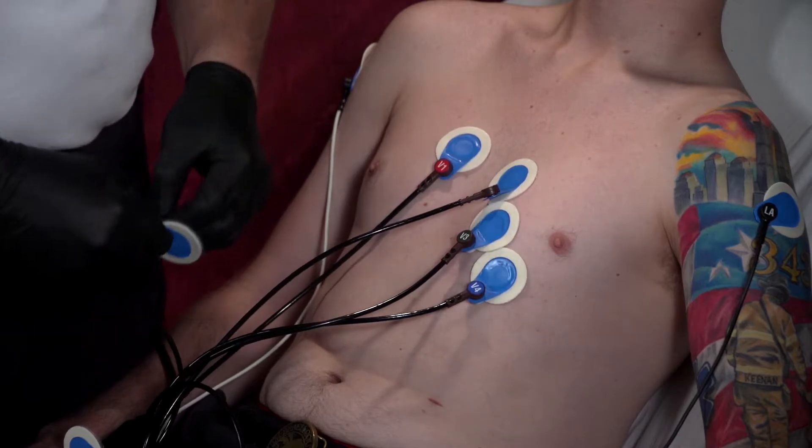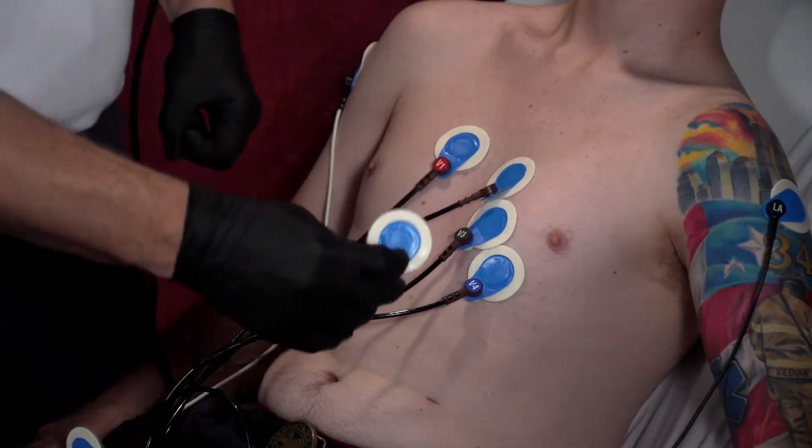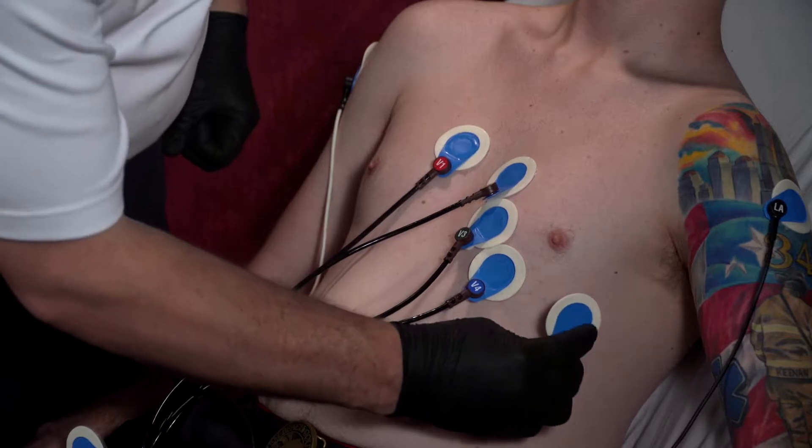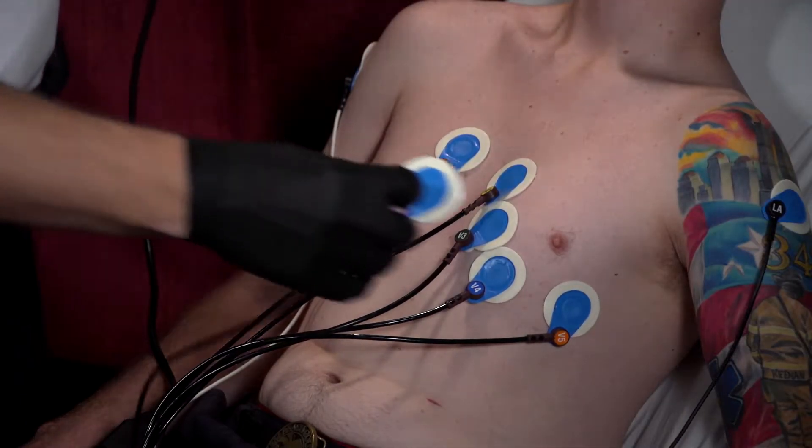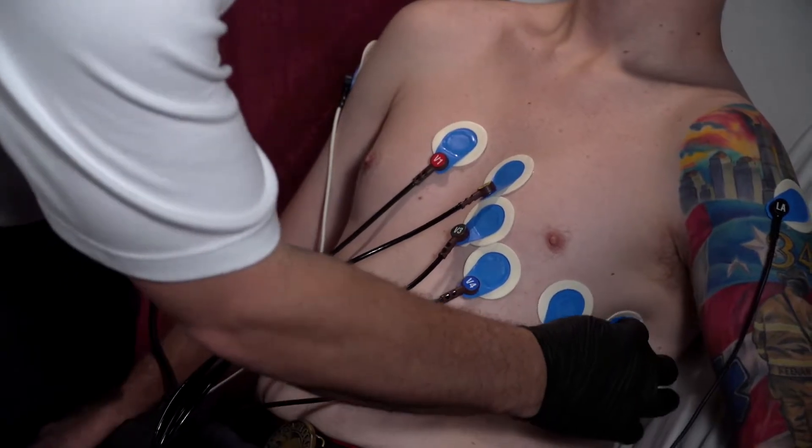The next one to place is V5. V5 is going to go on the same line as V4, however this is going to go on the anterior axillary line. The last lead to place is V6, which is going to go on the mid-axillary line on the same plane as V4.